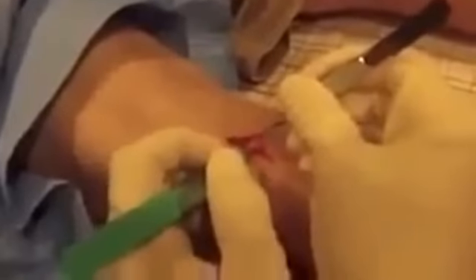Using some tweezers in my right hand and the scalpel in my left, I just very carefully and slowly cut the connective tissue so that we have access to the cyst. And you can see the white area in the incision I make, and the cyst is beginning to be revealed more and more.